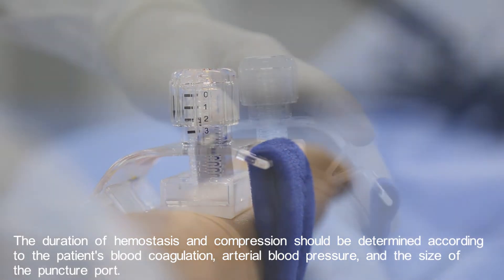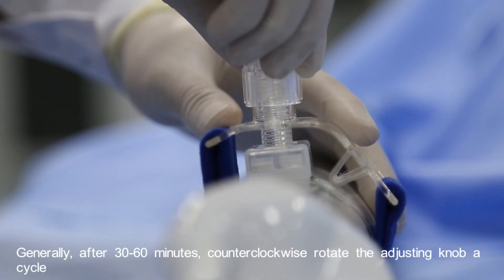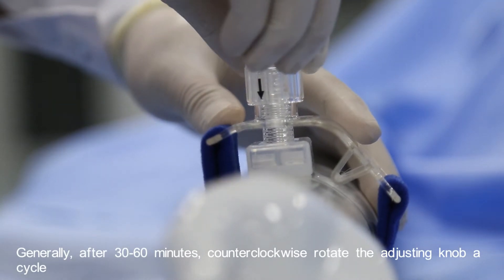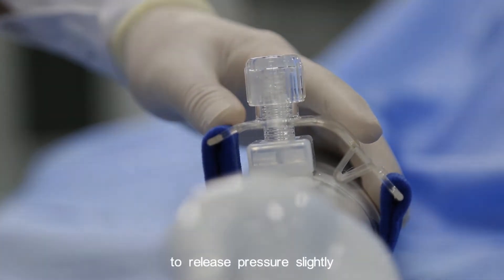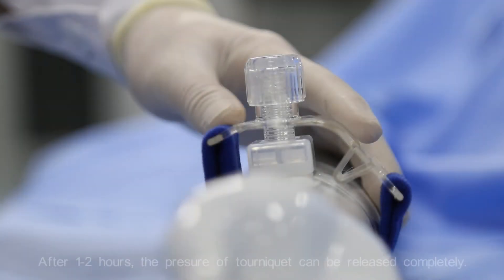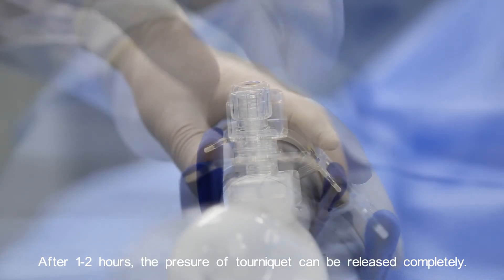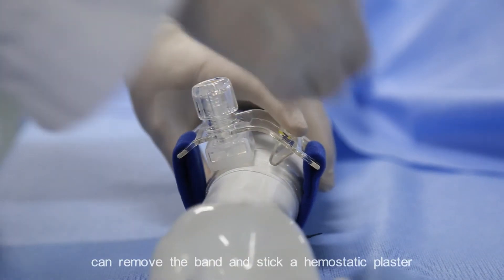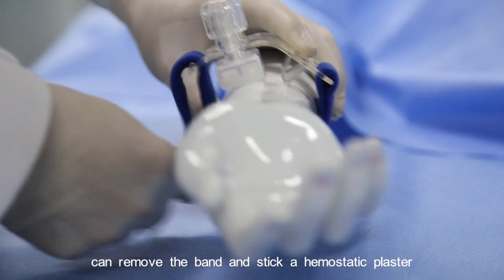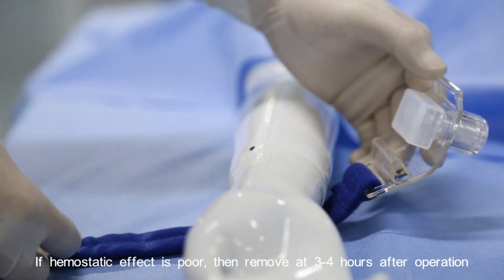Generally, after 30 to 60 minutes, counterclockwise rotate the adjusting knob in cycles to release pressure slightly. After one to two hours, the pressure of the tourniquet can be released completely. Observe for two minutes without bleeding, then remove the band and apply a hemostatic plaster. If the hemostatic effect is poor, remove it three to four hours after the operation.